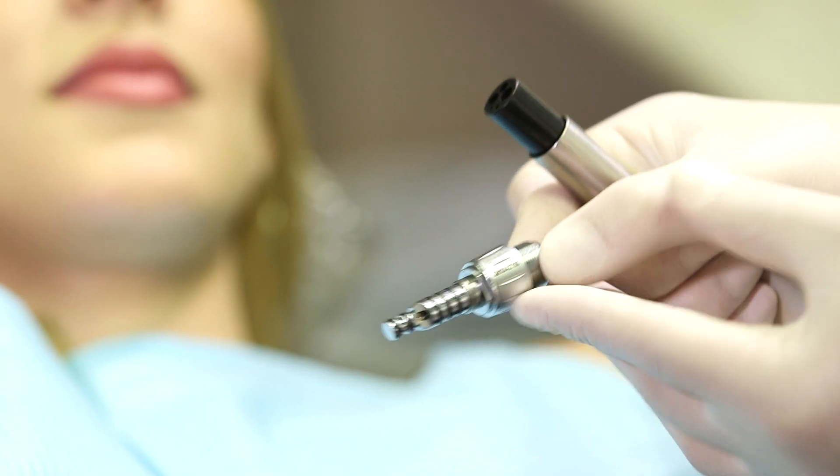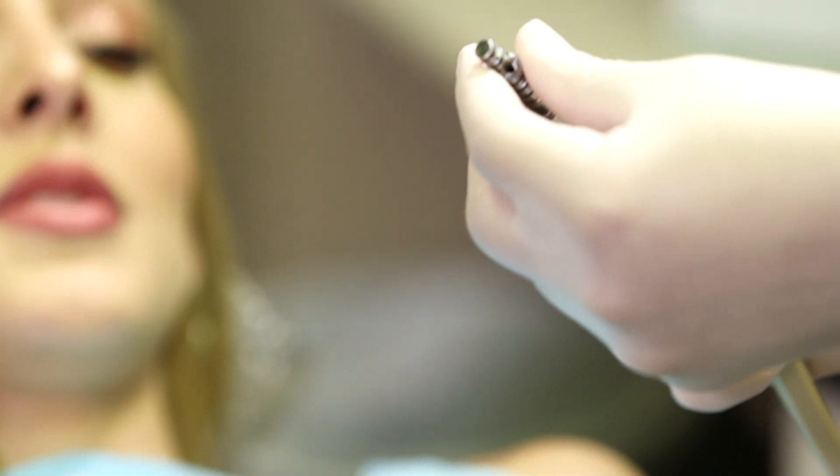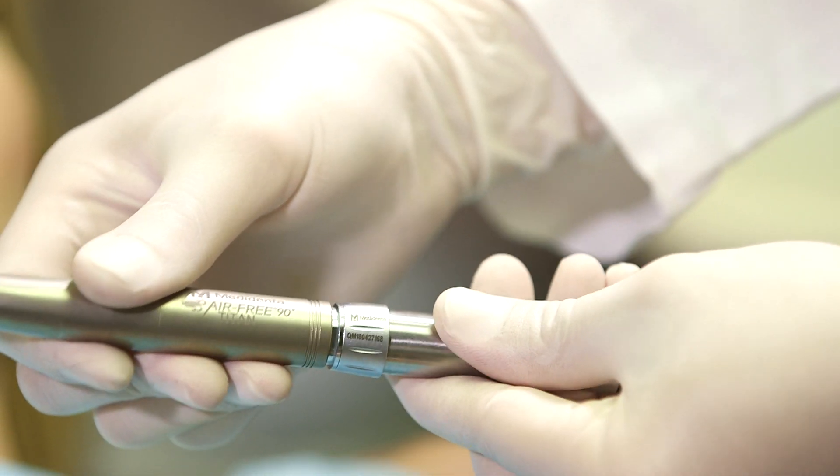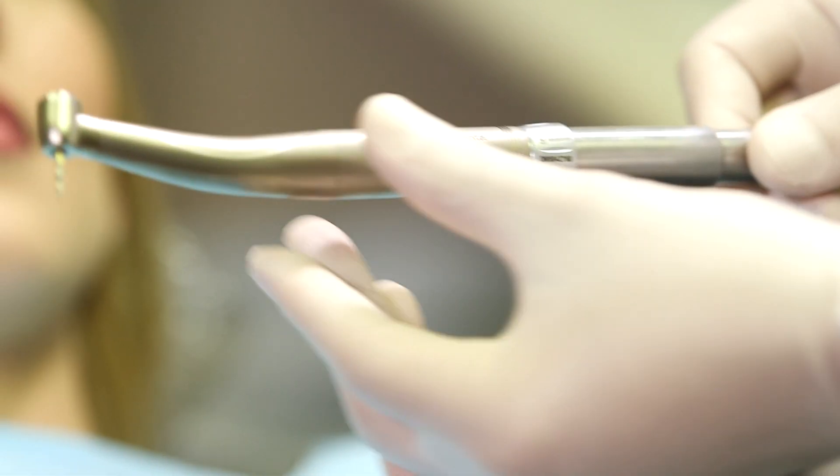MediDenta provides a diverse selection of accessories tailored to complement various handpieces. Our range includes a variety of couplers, such as the air-free Titan coupler.